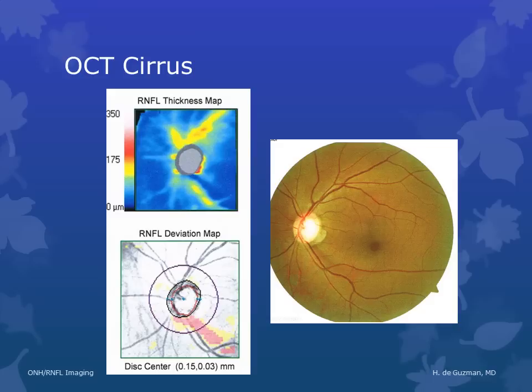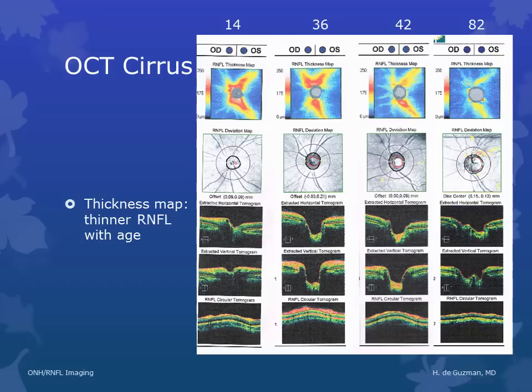This is an example of a focal RNFL defect that shows up well both on the deviation map and on the thickness map, and also correlates clinically with the RNFL photo showing an RNFL wedge defect in the same area. As you get used to looking at thickness maps, you will become familiar with what the normal thickness map looks like for different ages. Normally you should find a bifurcated area of hotter colors superior to the disc and one large area of very hot colors inferior to the disc, but this tends to get thinner as we grow older without necessarily being glaucomatous.